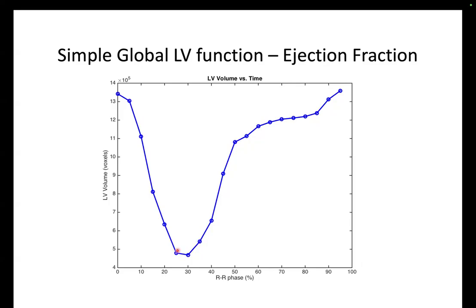These three positions would be great for doing that coronary artery image because the heart is essentially staying relatively still at that point, but it really pops open quickly and blood flows in once the left ventricle relaxes. And then we see this long tail where it's essentially at its end diastolic volume. But as you can see, it kind of drifts and fills very slowly. So this time is a good spot to take a coronary image because the coronary is not moving as much.